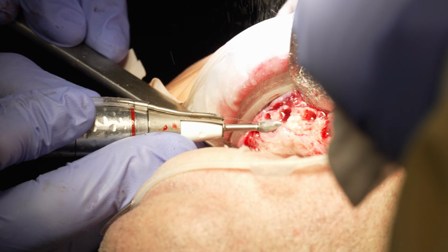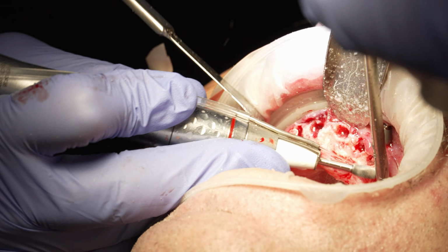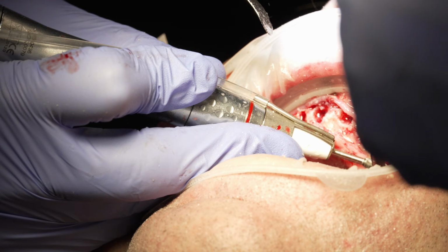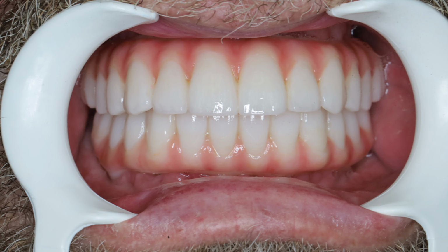In other words, on the day of the surgery, we're gonna file down the bone so it creates that much space. And so once we planned and eventually drilled the bone away, there will be a new crest of the gums. But also, this crest of the gums is going to be a transition line between the gums and the fixed denture in the future. And don't worry, you'll see all of this in a few minutes. But we plan for this because you never want to see this transition line when everything is finished.